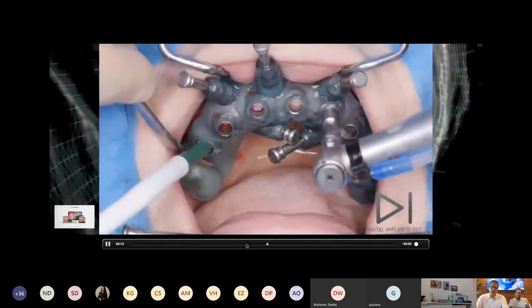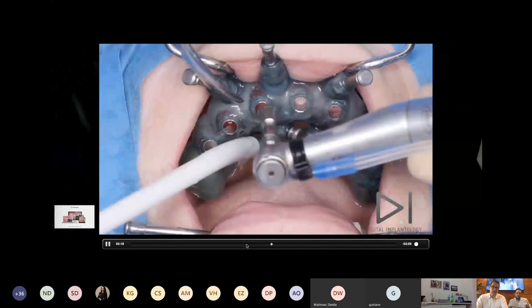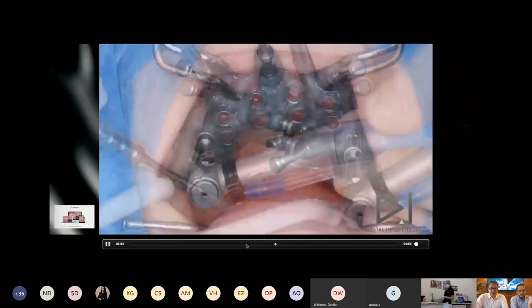And most of the time we spend 10, 15 minutes to manage one maxilla, and we spend a lot of time to manage a mandible, like Alessandro said before. But anyway, in this case the quality is very, very low, but we knew that before from this scan.